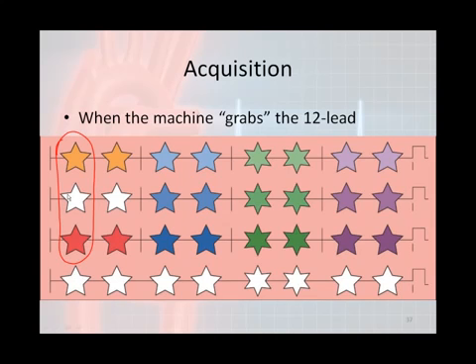Since it was printing at the same time, these 3 beats right here are related to each other, but this complex and this complex are not related. This is called the temporal relationship. This beat right here corresponds with every single beat above it. This is your rhythm strip down here on the bottom.